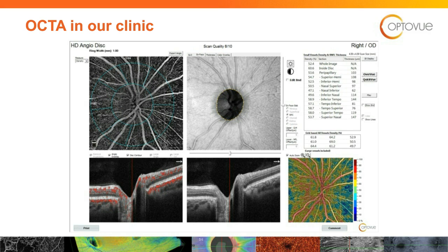This is what I wanted to mention from earlier. Notice at the top of this scan, we've got scan quality, top central, scan quality. And there's our 5 or 6 different tabs. You want to hit the en-face tab. And when you hit the en-face tab, again, there's other things you can look at, thickness, color overlay, etc. But when you hit en-face, it's going to bring up this screen.